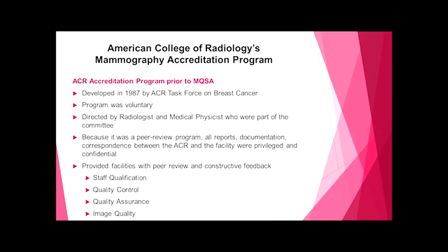The whole intent is to improve the quality of the procedure. It shouldn't be focused on anything that's punitive. It is about education. It is about peer review. It's about inviting people into your program, into your facility, to be able to say, hey, you do this really well. This needs to be improved. This needs to be done. So sometimes I think we get so focused on the accreditation issues and dotting the I's and crossing the T's that we have to back up and remember what the overall intent of the program is.